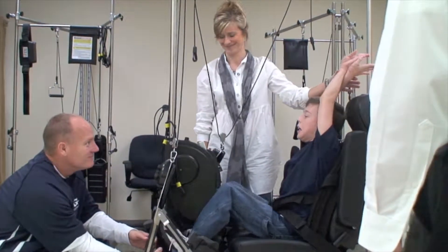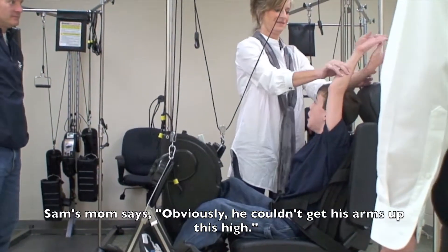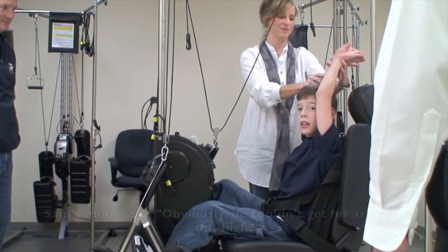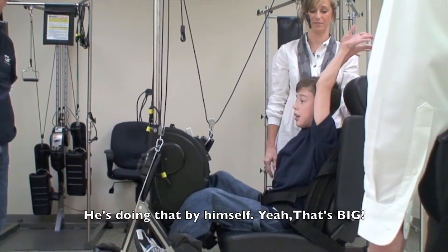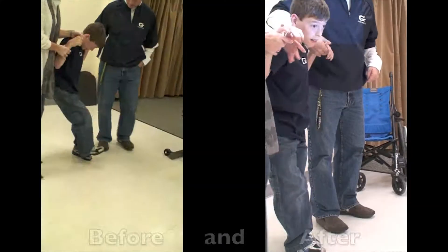Look at those arms — get his arms up that high. That's amazing, look how straight. That's big. It is. Straight for you too.